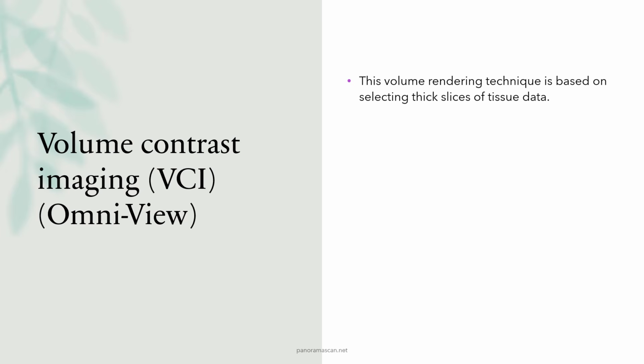VCI is a real-time technique, meaning that the images are generated on the spot, without the need for post-processing. This real-time capability allows the sonographer to assess and adjust the image immediately, facilitating quicker decision-making during the exam.